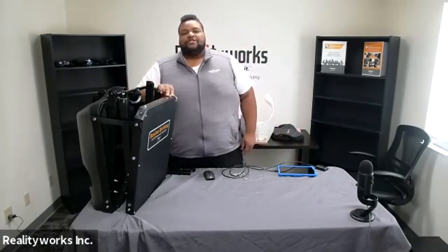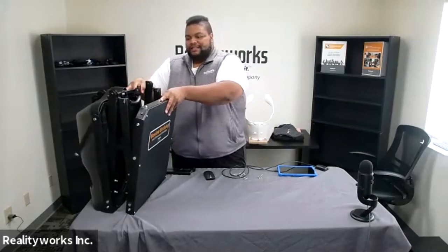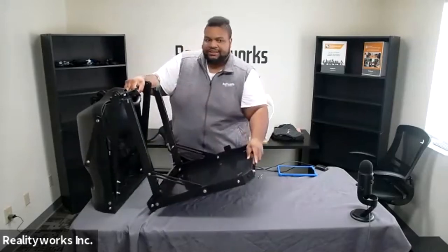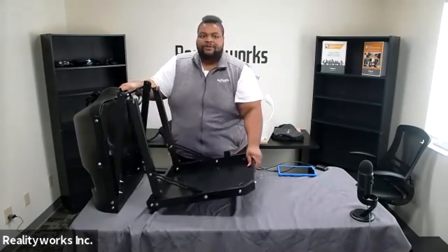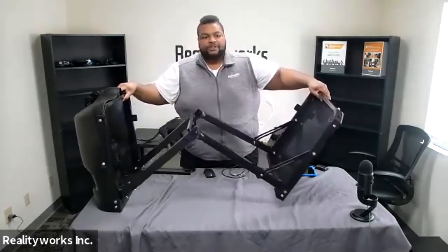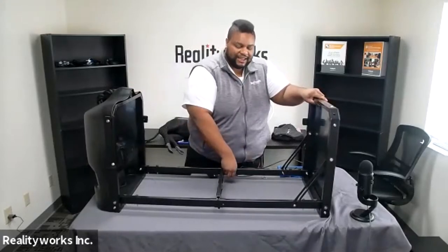Now let's talk about setting up the bovine birthing simulator. First, to set up the frame, you want to unstrap the frame and lower it from the front brackets, lower the front bracket until the brackets latch, then extend the frame out the rest of the way until the lower beams are straight, and then insert the pull pins to lock the beam into place.